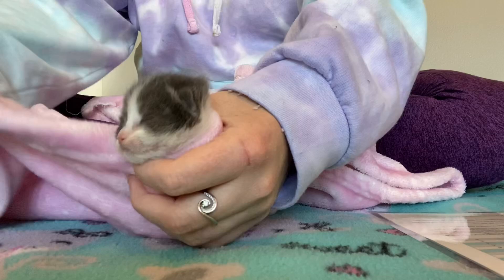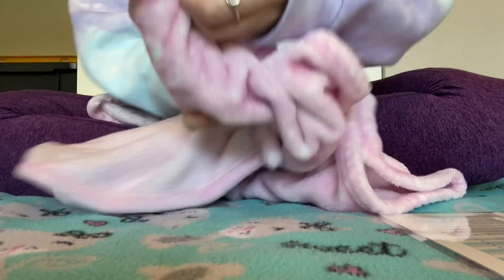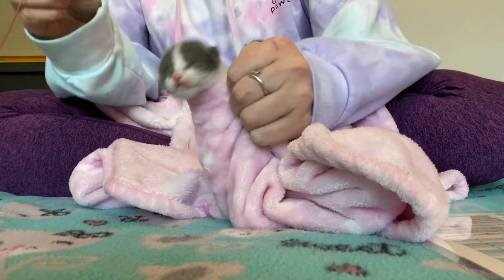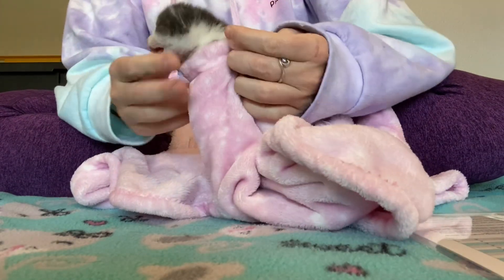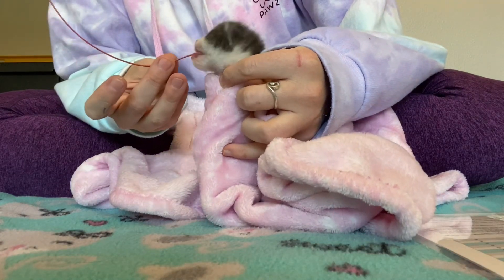Now, I'm going to burrito Mouse so that he cannot pull the tube out using his little paws while I'm trying to tube feed him. You're going to position the kitten with the head forward — honestly, even more forward than this, tilting him a little bit further.